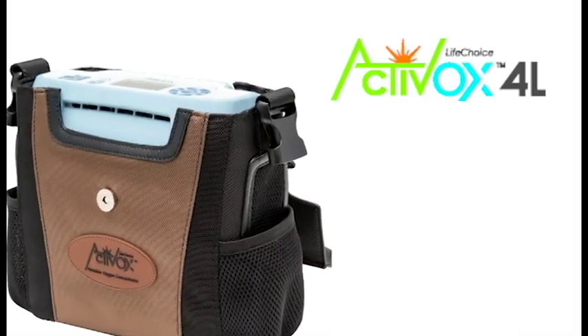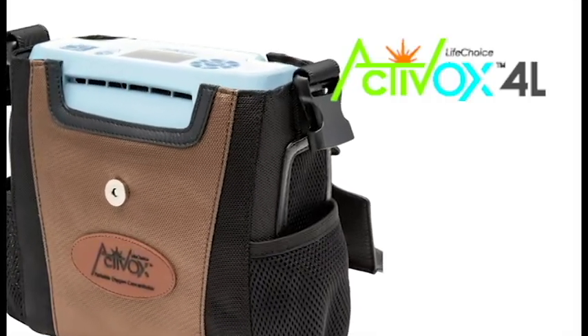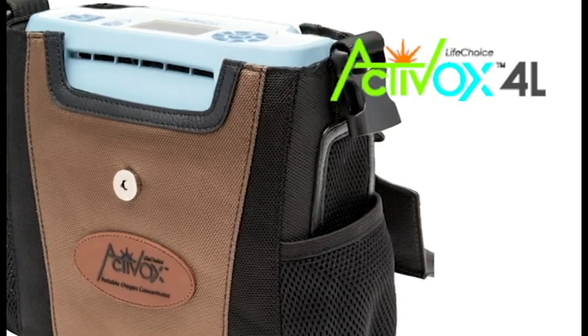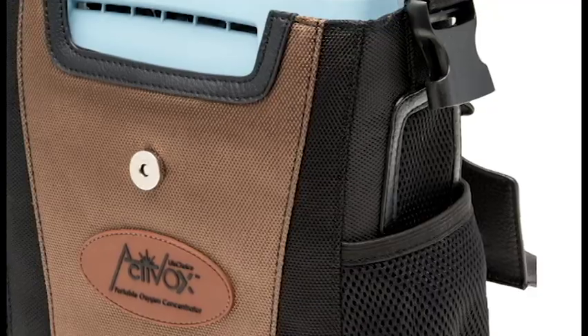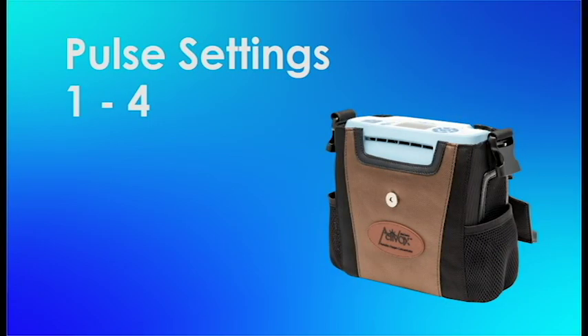First Class Medical would like to introduce the newest LifeChoice Activox 4L. The difference between the new LifeChoice Activox 4L compared to their older models is that the new 4L will go up to a pulse setting of 4 instead of 3.